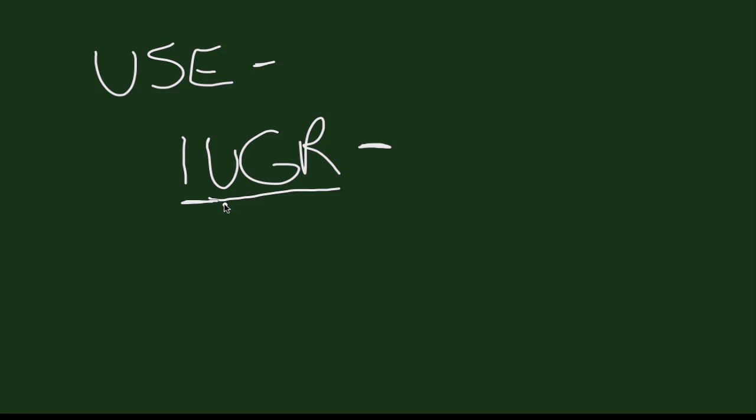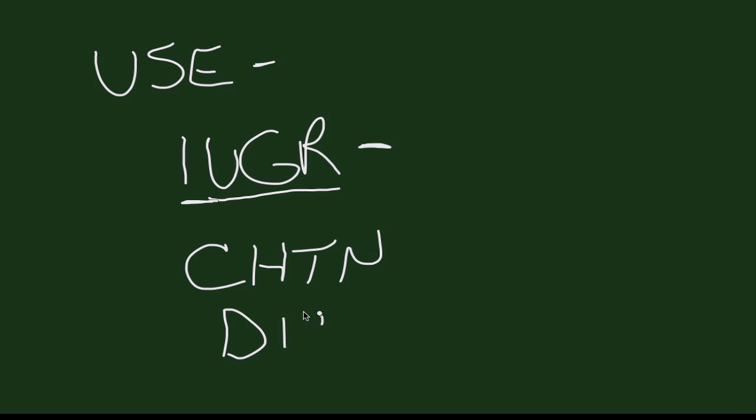It can also be used in other disorders where uteroplacental blood flow might be compromised, such as patients with chronic hypertension, especially of long-standing nature, and those who require medications and are not well controlled. Patients with diabetes, with renal involvement, or any other vasculopathy, as flow to the uterine artery can be affected by this. Patients with sickle cell disease can also have abnormal Dopplers, and Dopplers can be used to assess these situations.